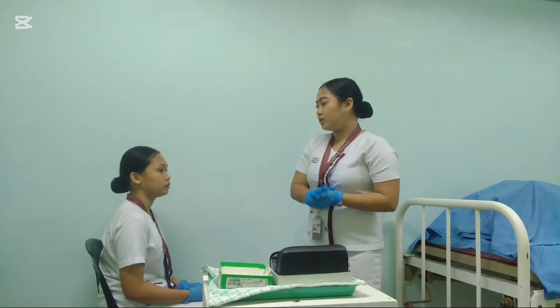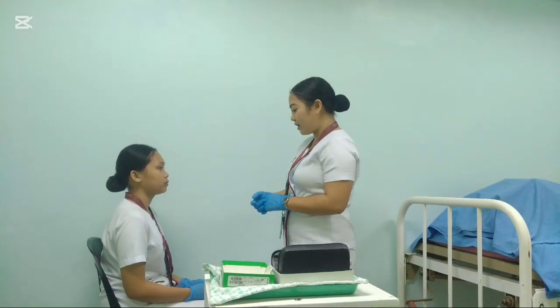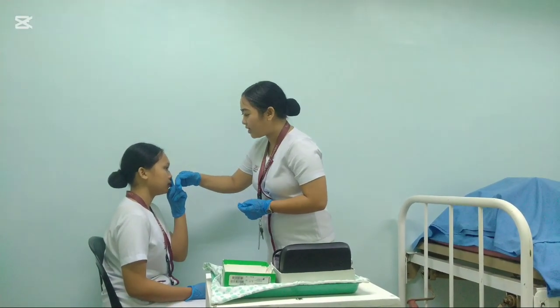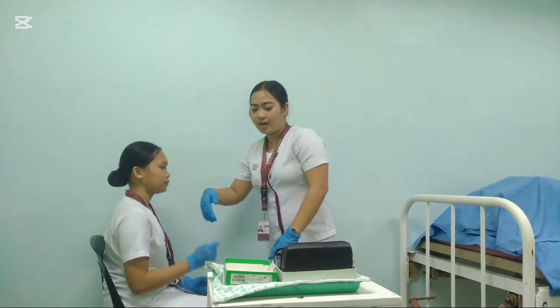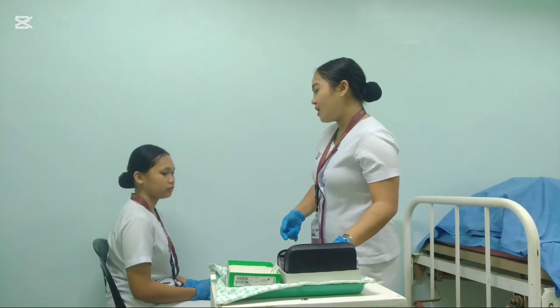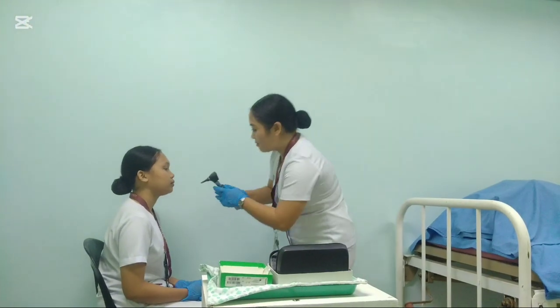Next is to use an otoscope. Before that, I will occlude the patient's nose. I will feel the breathing. Inhale, exhale. Okay, other side. Inhale, exhale. Okay. Next is to use the otoscope. I will examine the internal nostrils of the patient.